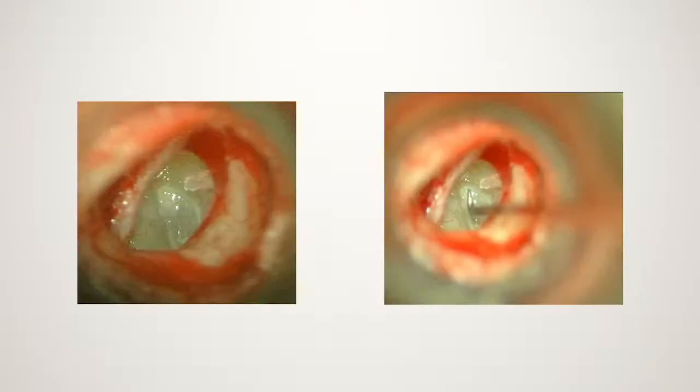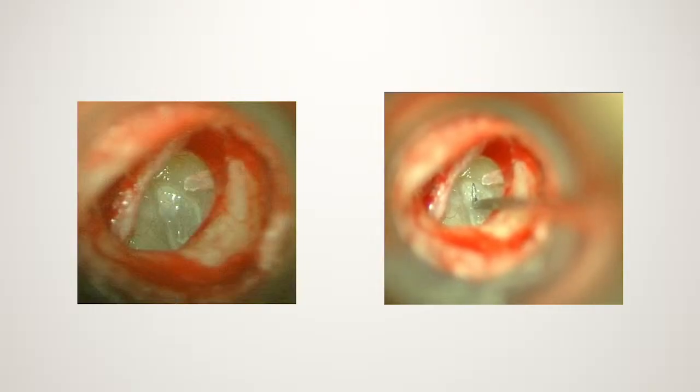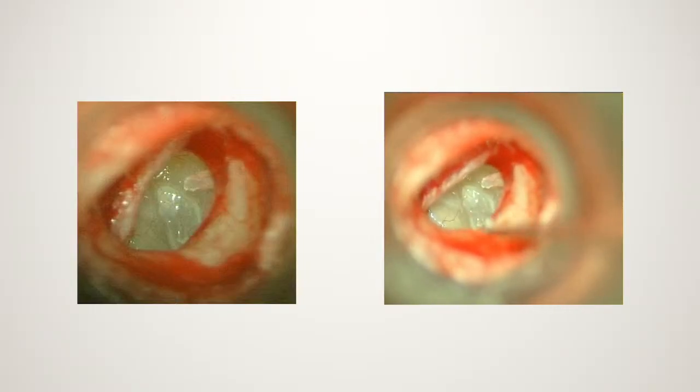So we get in, and that's what we find. You'll see that it's a mobile foot plate. There's a slightly eroded incus. Prepper, what are you going to do for this patient?